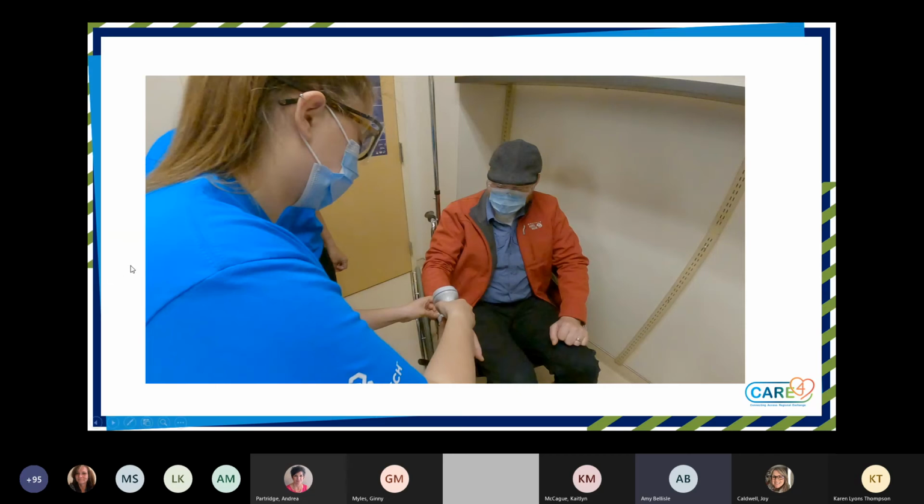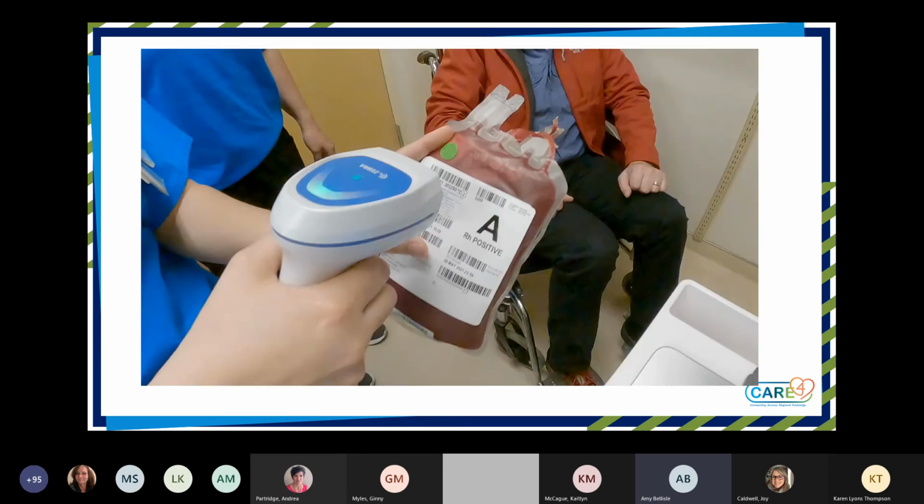So here you can see the picture that I've just shown. I did demo this yesterday, but I want to show it again because this is TAR related. This is our nurse scanning our patient. You can see that the scanner we're using is the handheld Zebra model to scan that patient. The next picture you'll see is the Zebra scanner scanning the blood product. We have 2 barcodes that we need to scan, the first, the upper one, is coming from blood bank, the unit number, and then the second is the product number.